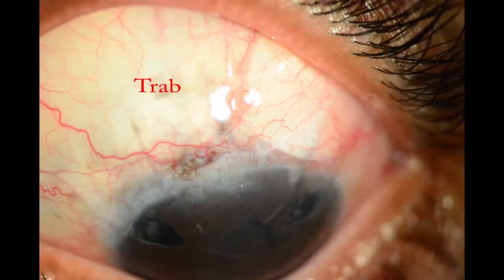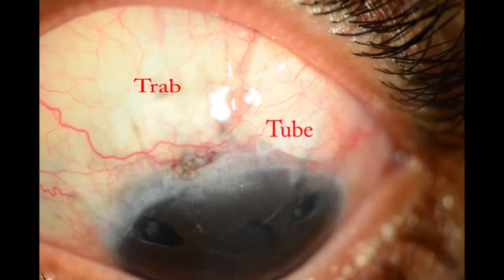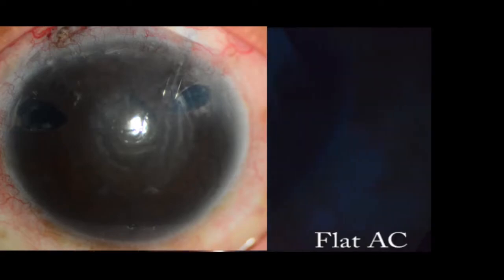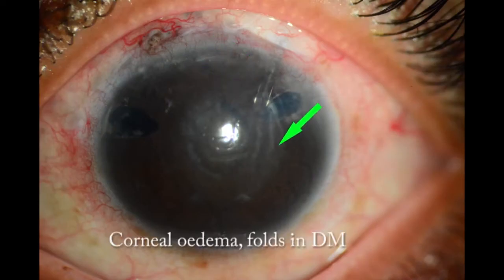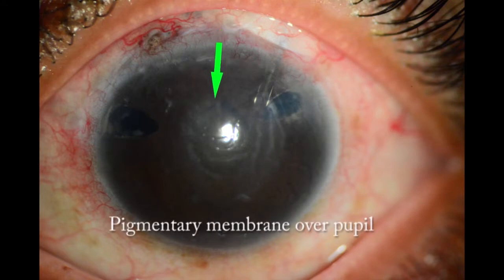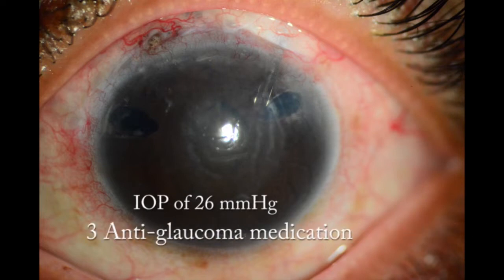In the first case, the patient had undergone multiple filtering surgeries in angle closure glaucoma and developed aqueous misdirection for which pars plana vitrectomy was done. She presented to me 6 weeks later with flat anterior chamber, previous tube barely visible, early signs of corneal decompensation, patent PI, pigmented pupillary membrane, and count fingers vision with high intraocular pressure on anti-glaucoma medication and atropine.